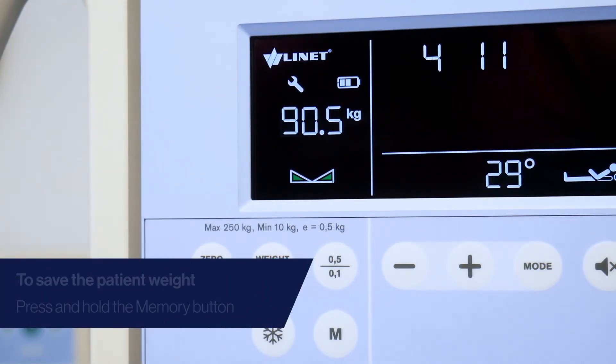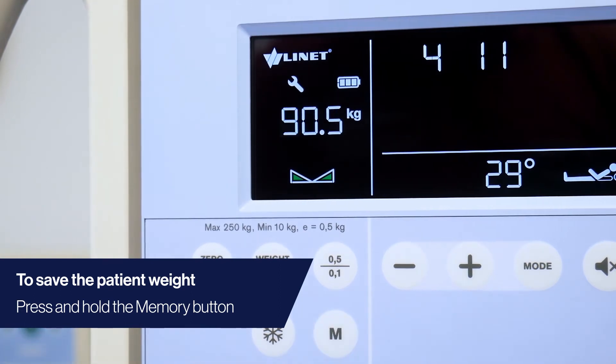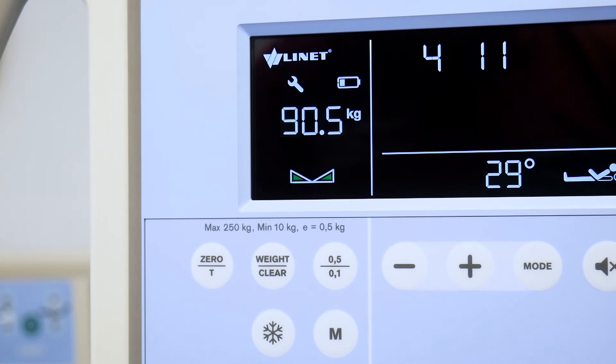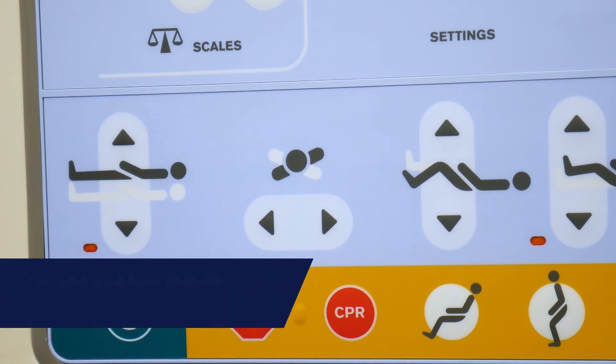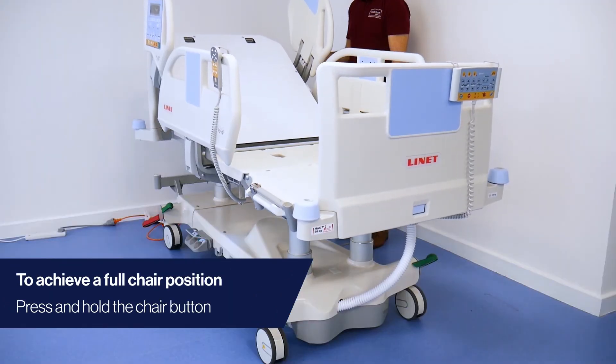To save the patient weight, press and hold the memory button for 2 seconds. The value will flash before it saves and can be accessed at any time by pressing the memory button again. Please note that only one weight can be saved per day. To achieve a full chair position, simply press the chair button on the iBoard control panel.